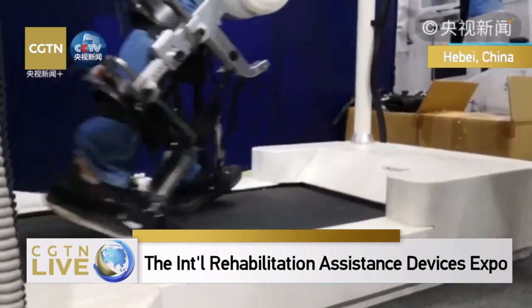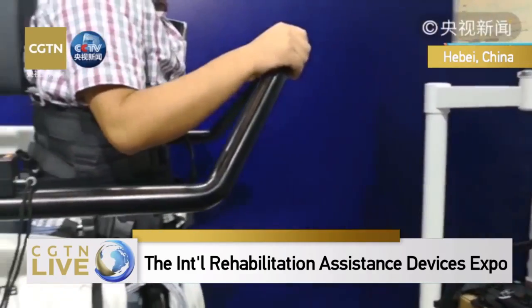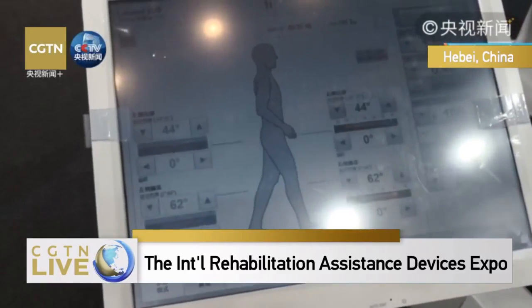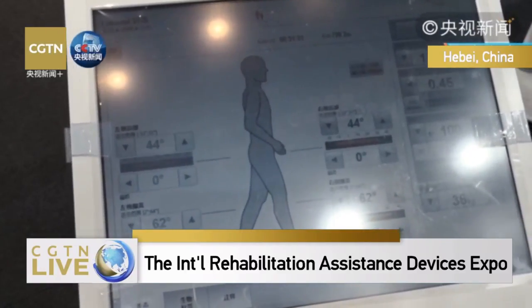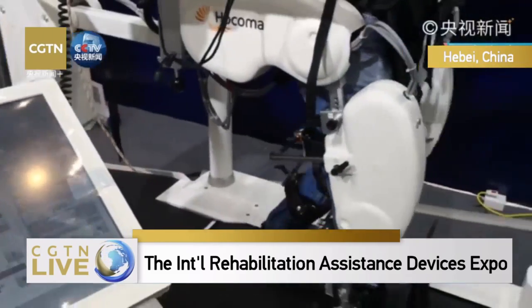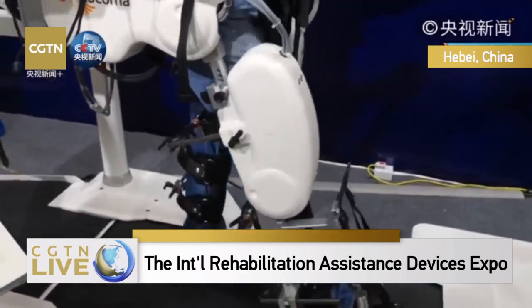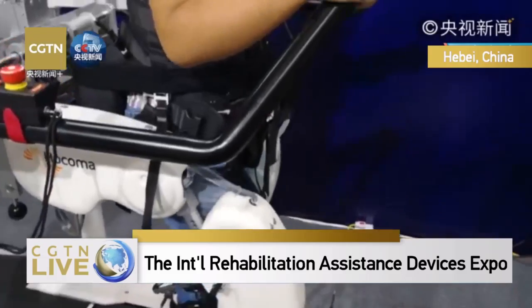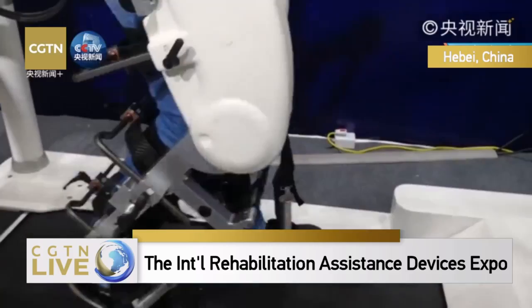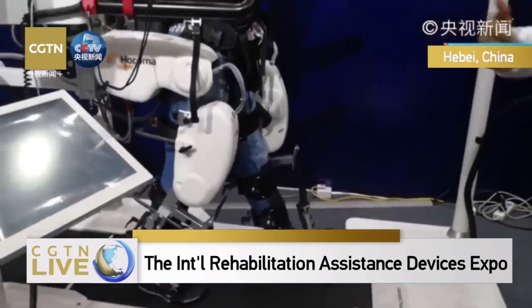Here we can see two screens with a lot of statistics. Can you brief us on these statistics? As you can see, this is a limb rehabilitation robot. It helps those with motor disability on the lower limb to conduct some preliminary, first stage restoration exercise.